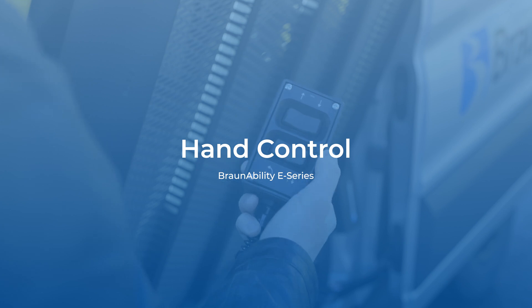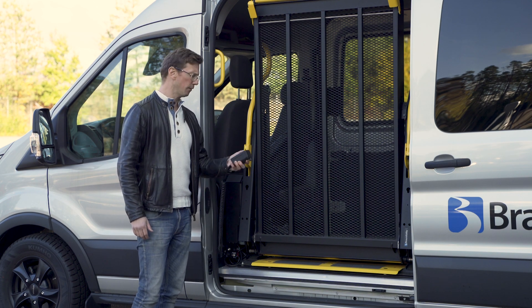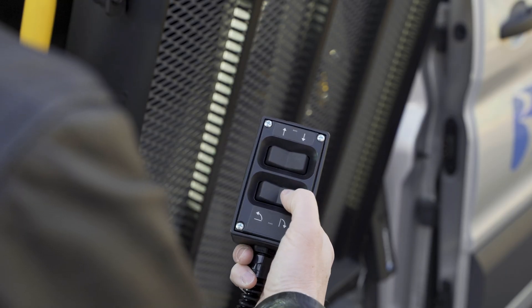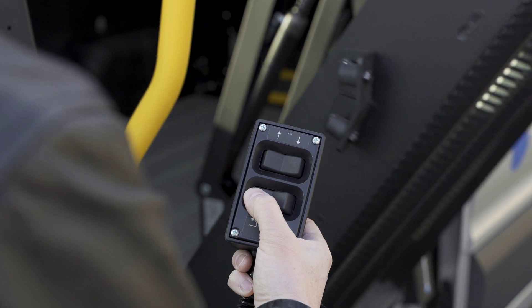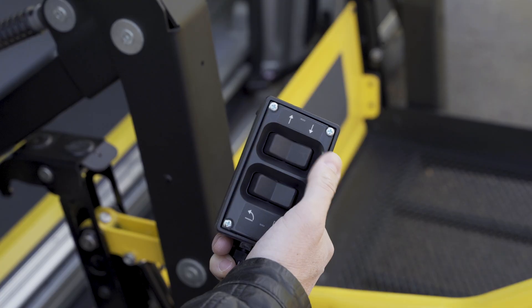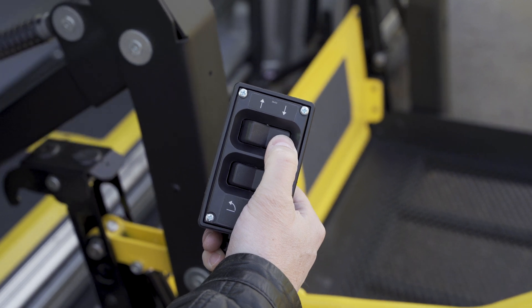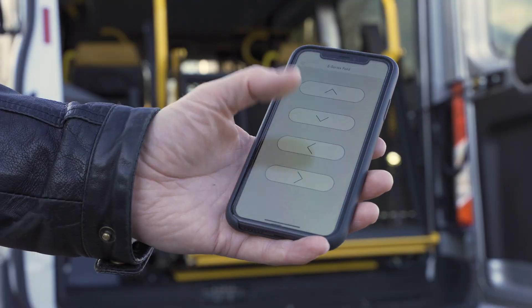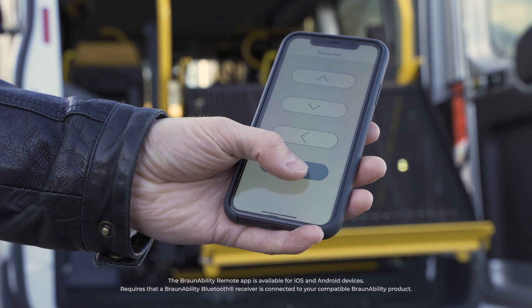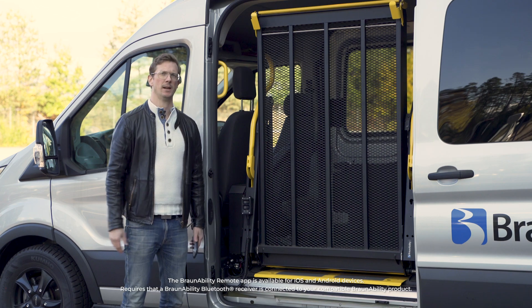Designed to take a beating, the robust hand control features two rocker switches that let you control all the functions of the lift: unfold, fold, up and down. The plastic body makes the hand pendant comfortable to hold in all temperatures. You can also control your lift via your smartphone — just add our optional remote kit and you're good to go.